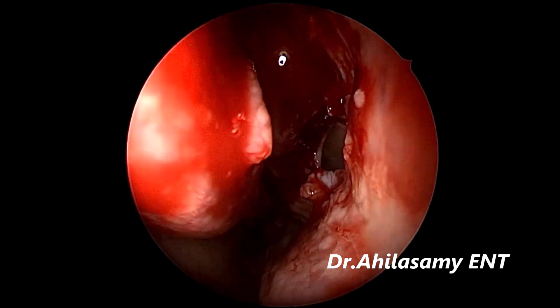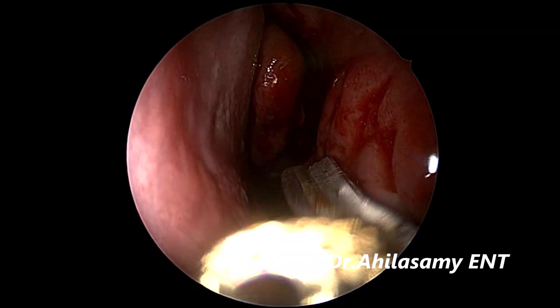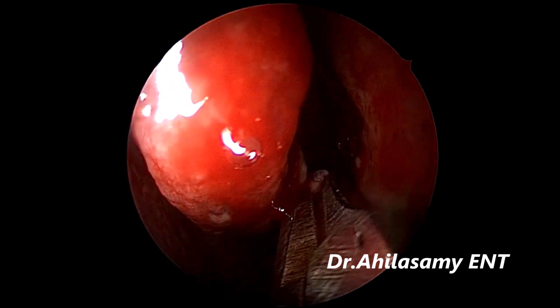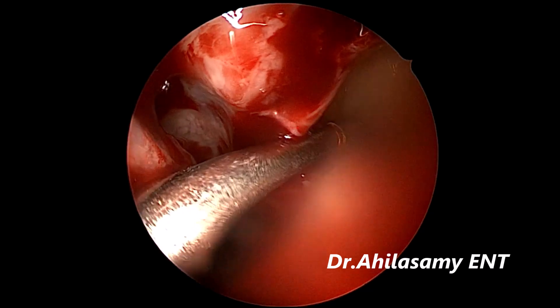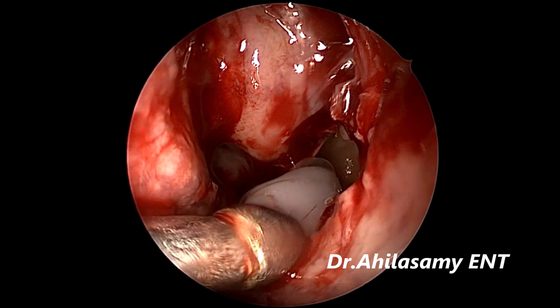Now already the MMA is open wide, and I am using the through-biter to still more widen the posterior lip of the MMA. That is middle meatal antrostomy. You can see the MMA coming into view. That is secretions. I am using the curved sucker to suck out the secretions.